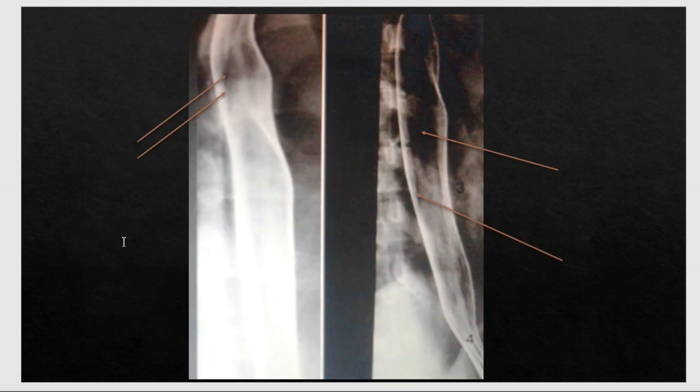Indications we have already discussed. Here you can see the esophagus, the presence of the air, more specifically the CO2, and the opaque one, the barium lining, right? Here is the diaphragm. This is the hiatus with which the esophagus enters the diaphragm opening and it goes inside the stomach, this area. It goes inside the peritoneal cavity.